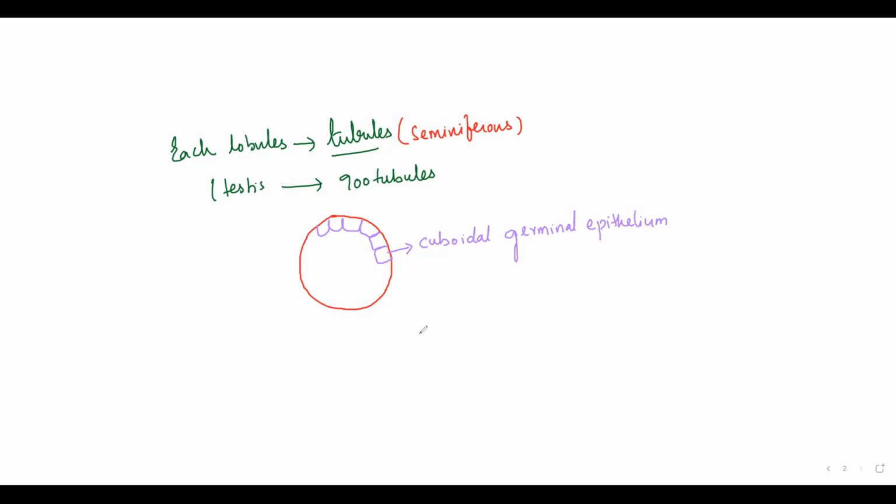Here you can see there are specialized cells inside the seminiferous tubules, and these specialized cells forming up here are the Sertoli cells.